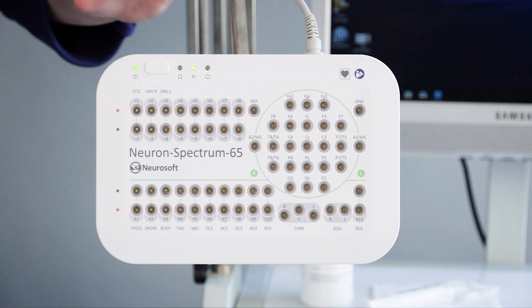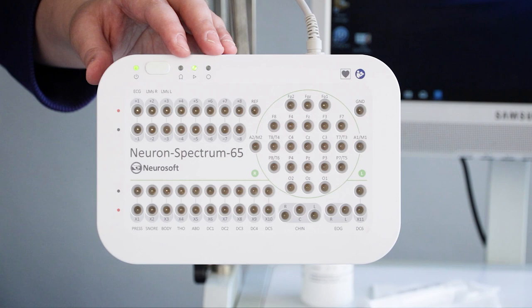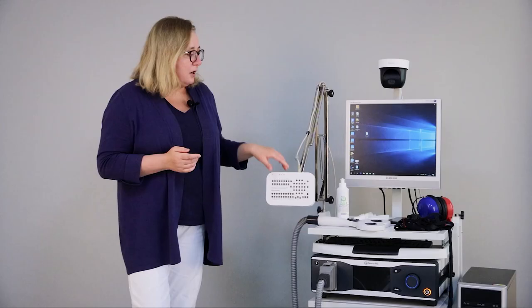What do we need to perform this technique? First, we need a special EEG amplifier. I will use our Neuron Spectrum 65 EEG amplifier — please pay attention, this amplifier is TMS compatible.